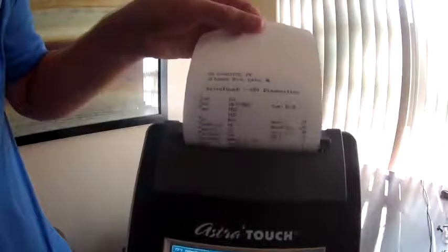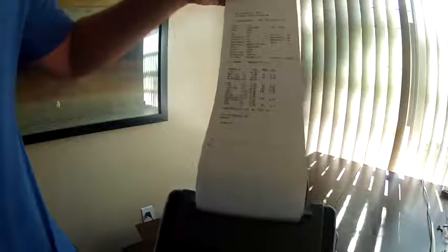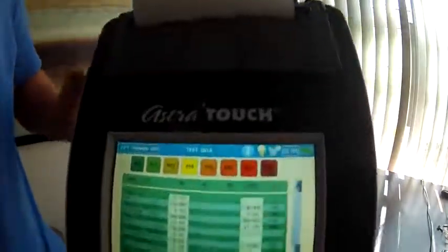Now I'm going to print it out by touching this button. You can see it's starting to print the test results. What you can do with this printout is scan it into your EMR system, as most EMRs allow. Or you can connect the spirometer to your computer with the included software, and it will convert the results to a PDF document which you can import into your EMR. This way it interfaces with every EMR out there via the PDF file.